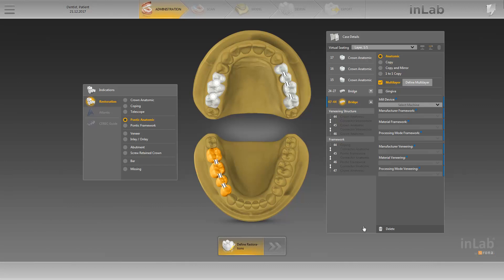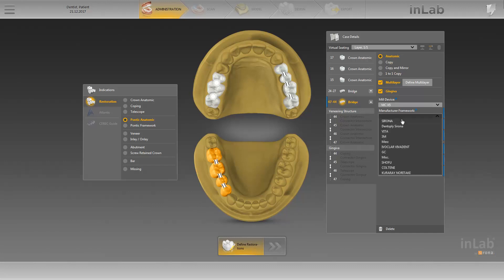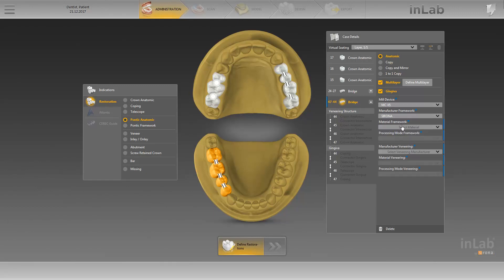Now that we have defined the structure of the bridge from 4-4 to 4-7, we select the mandatory fields and define the mill device, the framework manufacturer, the framework material, the veneering manufacturer, and finally the veneering material.